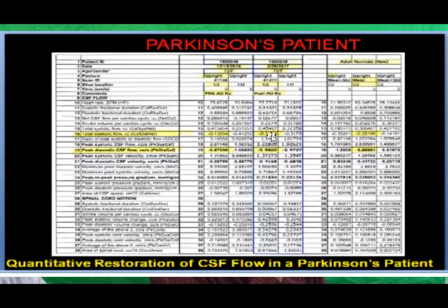So what I'm showing you here is not just what I showed you in the movies of the cerebrospinal fluid going in and out alongside the spinal cord, but the additional power to measure it in cc's per second, which is worth its weight in gold. Yeah, definitely a promising technology.